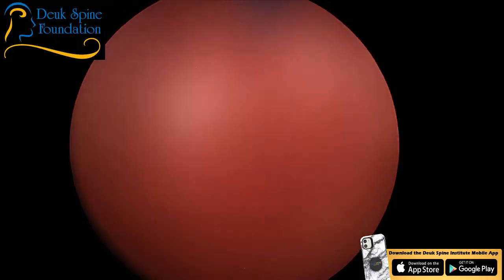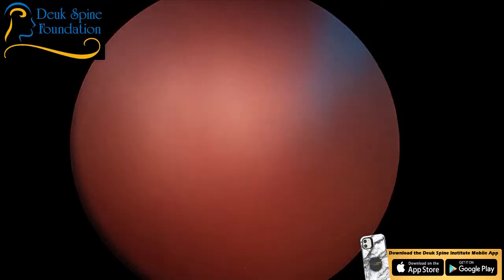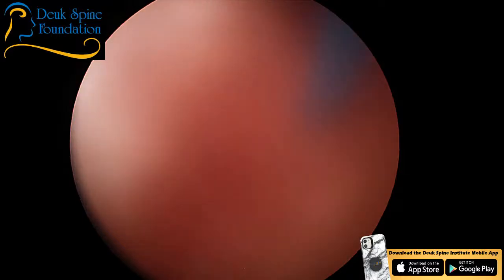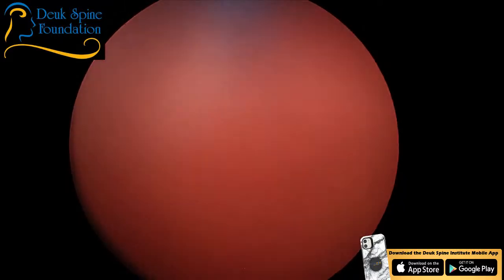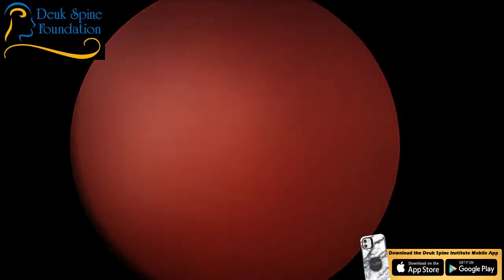Well, unfortunately, this happens sometimes where the oozing from the little bleeding end plate or bone spur or little epidural vein, whatever it is, just wants to obscure the view, and we have to deal with it. So there's not much I can do about it. So just bear with us, folks. It's a good time to ask questions if you have any. Stand by.